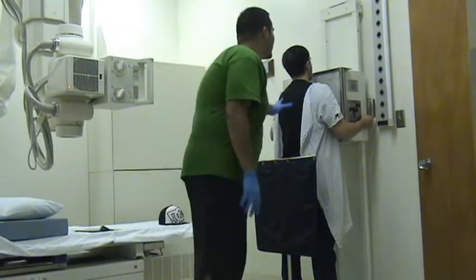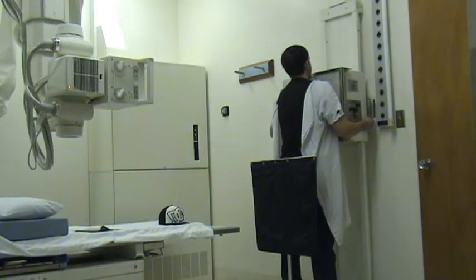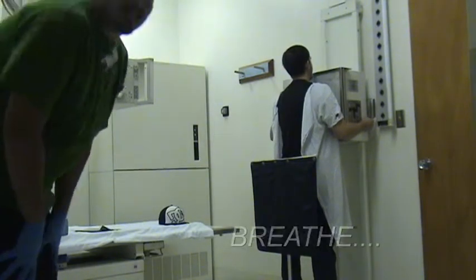So sir, go ahead and roll your shoulders in. You're good. Take in a deep breath for me, please, and hold it. And then you shoot it, and that is your PA chest x-ray.